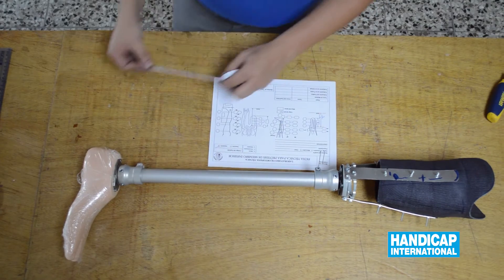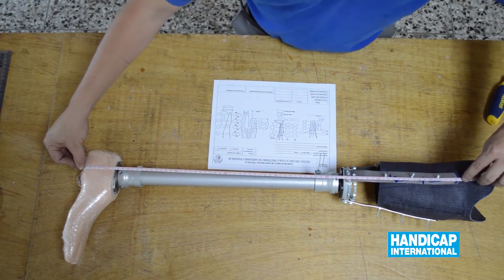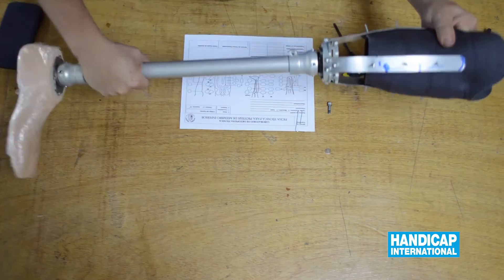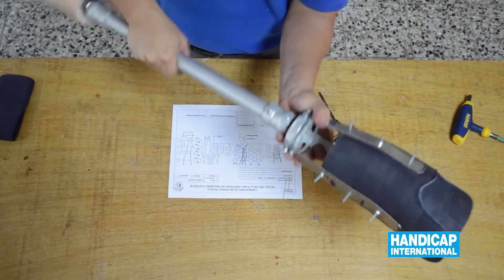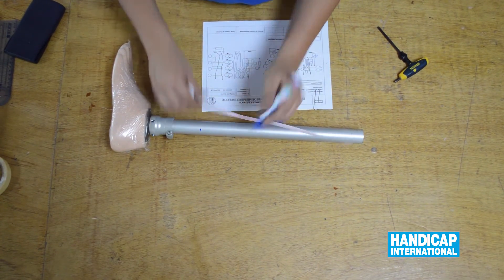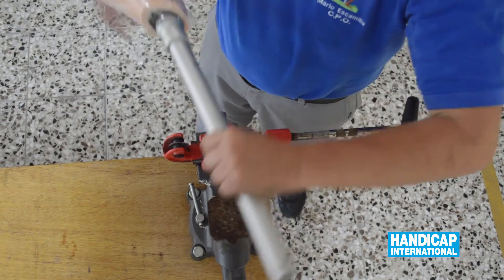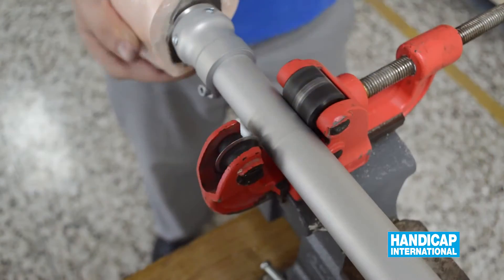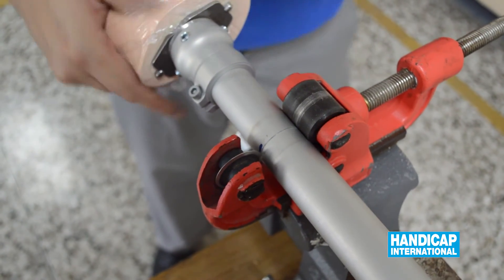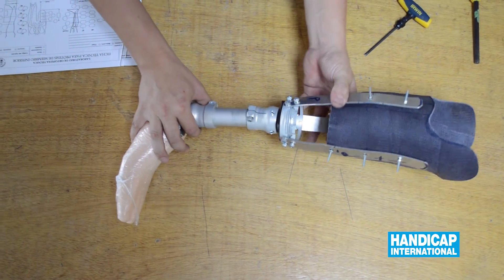Verify the measurement of the length of the prosthesis from the patellar tendon to the ground, mark the right length on the tube, and cut it. Assemble the prosthesis.